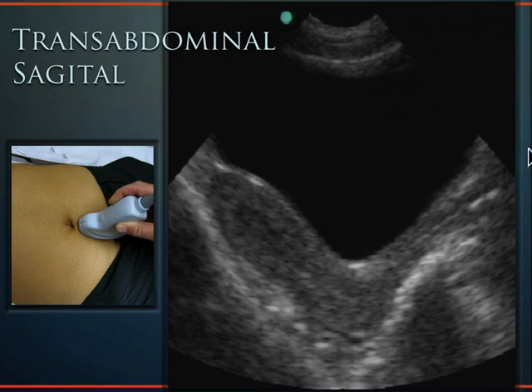Now, if I took the intracavitary probe, or the endovaginal transducer, and I inserted it into the vaginal vault, I would eventually come to the cervix, and when I land on the cervix, that's when I stop inserting the probe, and the sound comes out over this whole area right here, and I get really high-res pictures of the uterus and the pelvic contents, because I've got that high-frequency transducer. So I'm just kind of throwing this all out there for anatomy and stuff.